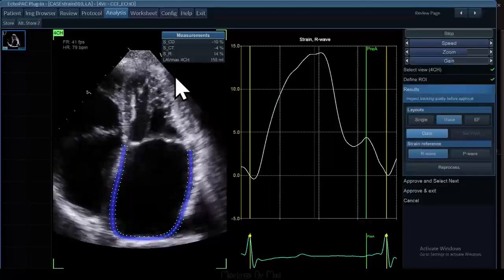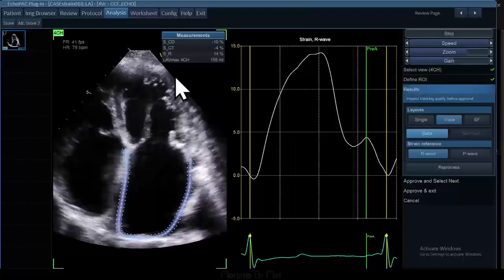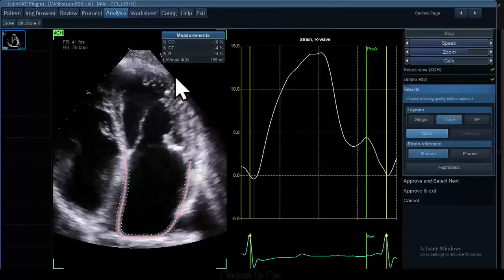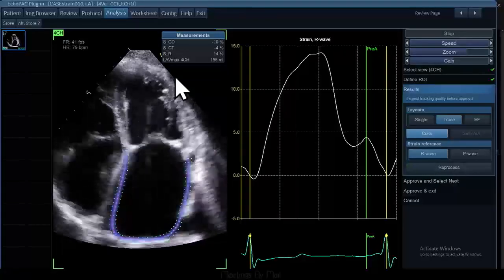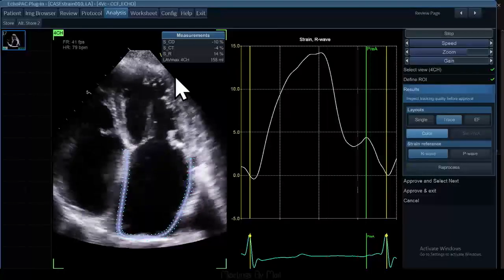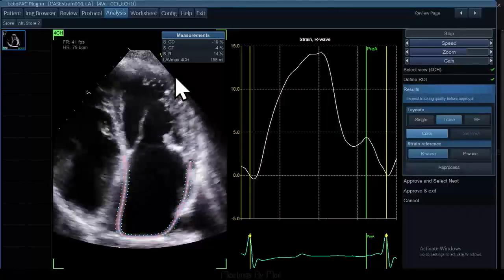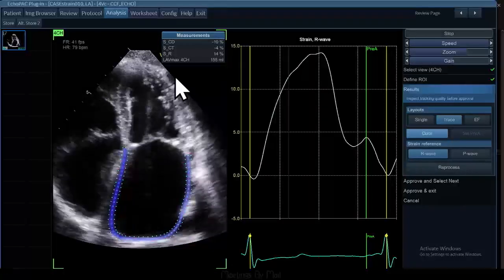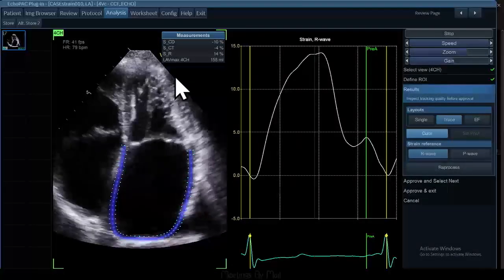So the question was, how does mitral annular calcification affect your LA strain? It shouldn't affect it too much unless you have something like a mitral stenosis. The strain, like the pulmonary vein, can be affected by MAC. So it's more the chamber preceding the mitral stenosis, in a way. Thank you. Good question. Any other questions?